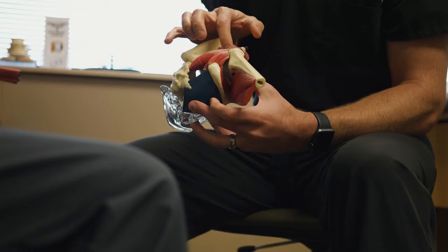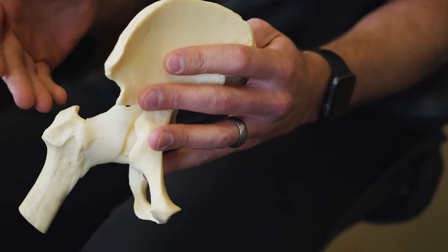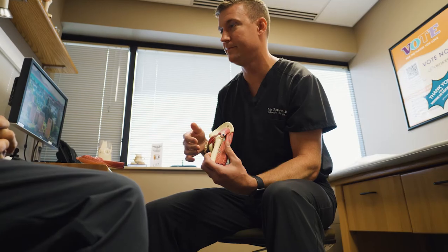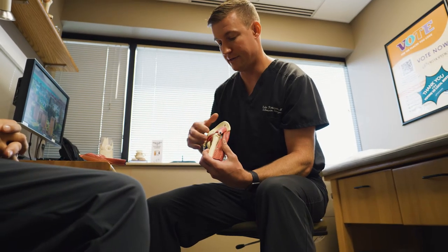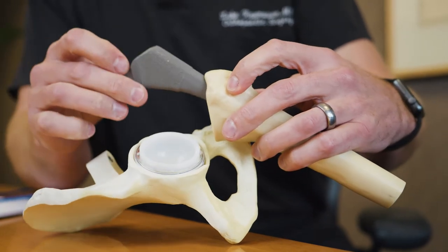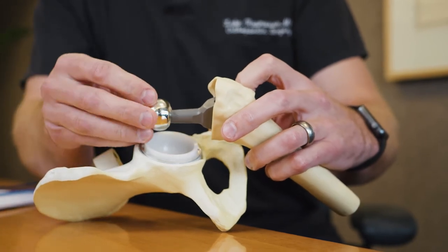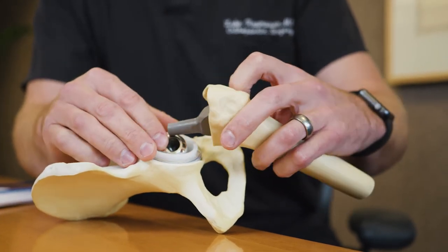One of the things that makes SuperPath very interesting is it marries the traditional open approaches to the hip and the arthroscopic methods that we developed. So instead of making a very large incision and opening up to be able to expose the acetabulum and to place the cup, I actually use a portal that goes lower on the leg, and through that arthroscopic portal that's where I prepare the cup to be placed.